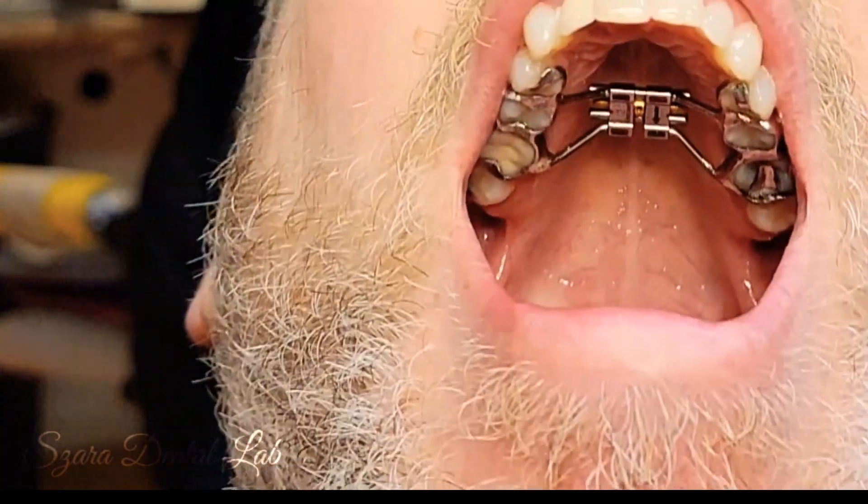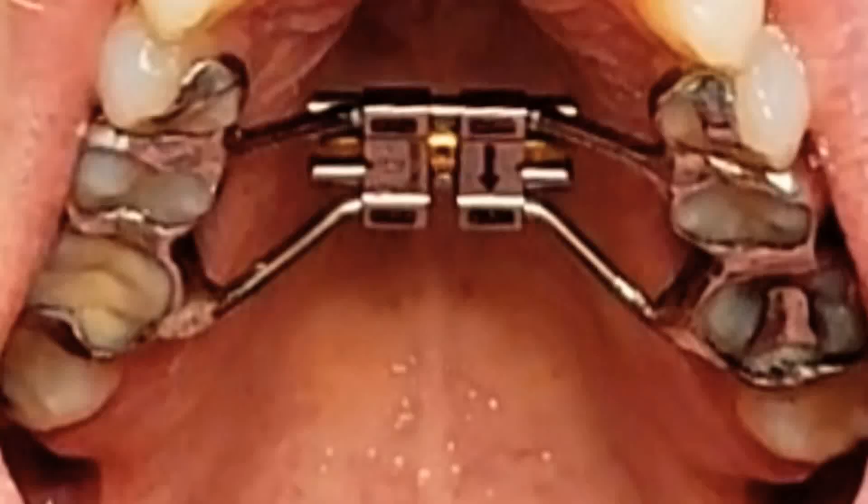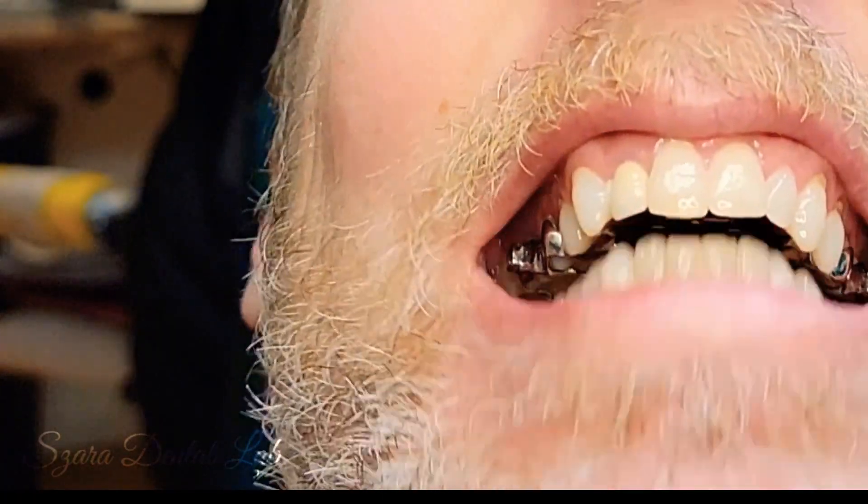I'm gonna put this in my mouth — and that's delivery. I'm now wearing an expander in my mouth. I've never worn one before, so now I know what it's like. It's going to make my voice sound a little different.